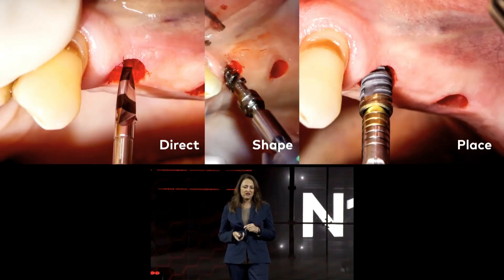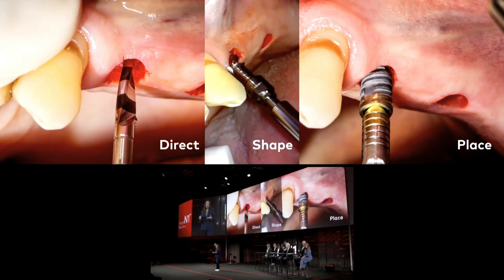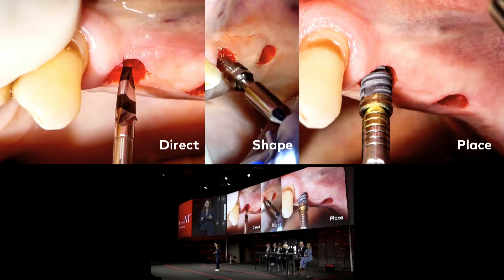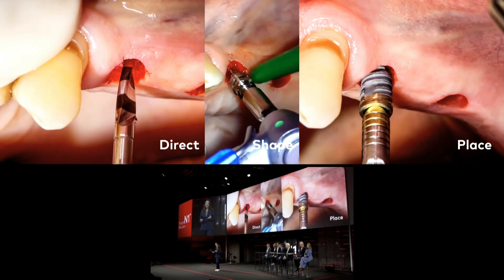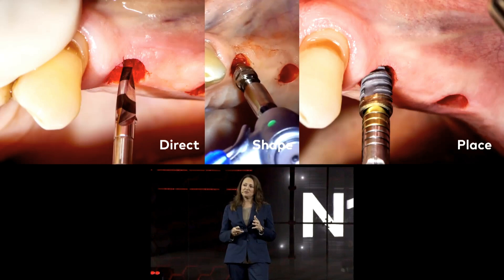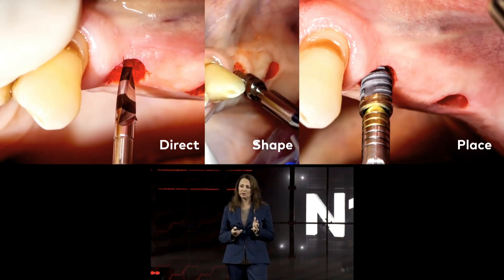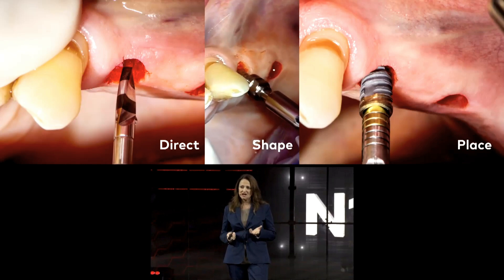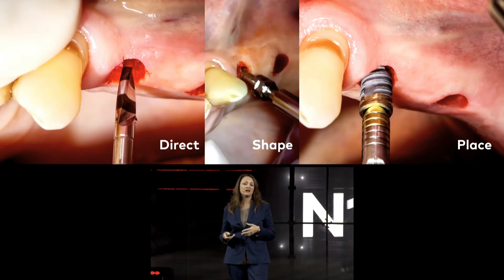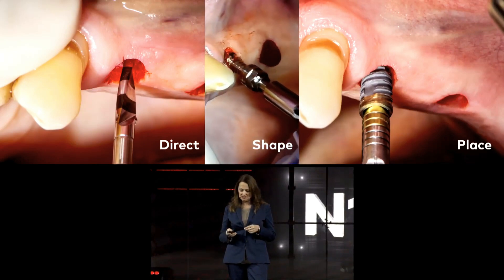The osteo-shaper is easily engaging the osteotomy, smoothly and passively following it. Looking at conventional drill protocols by comparison, the tip of the osteo-shaper is not cutting — that means it follows without deviations. The result is a much better drill hole than in conventional drill procedures. We do not waste our bone.